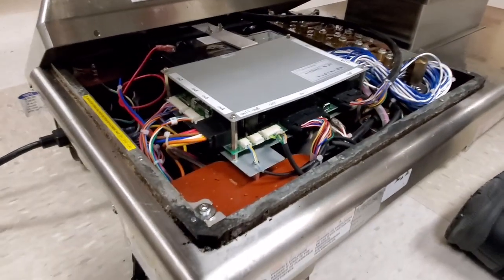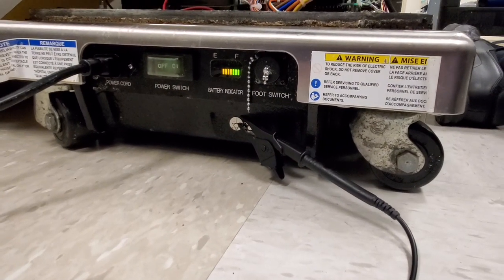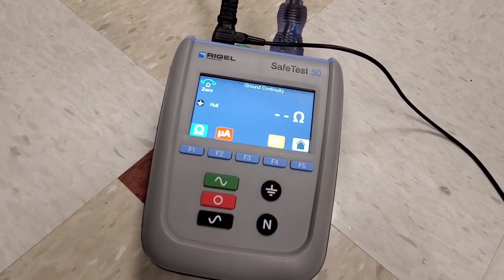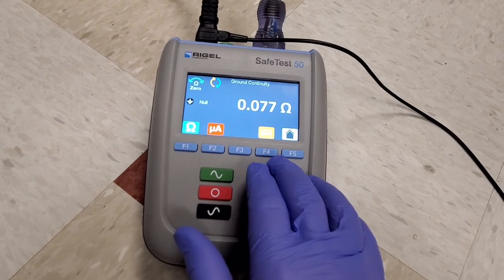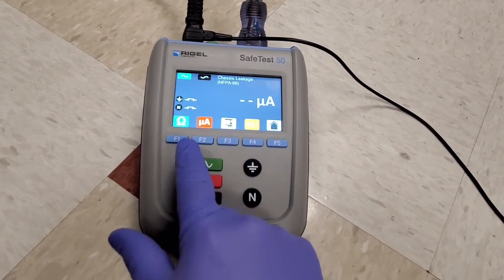All right guys, here we go. This is what the board looks like when it's installed back in the table. Down here I have a charge indicator that is not charging because I'm in the process of doing electrical safety. That's looking good — chassis leakage.